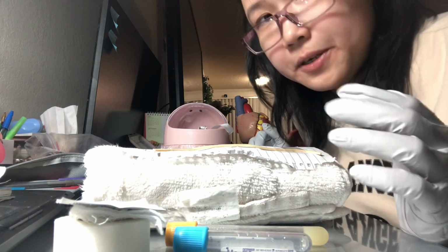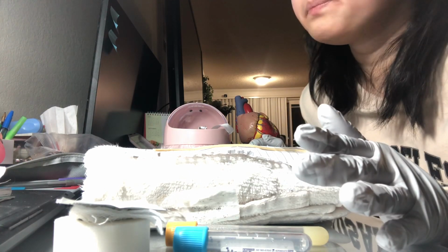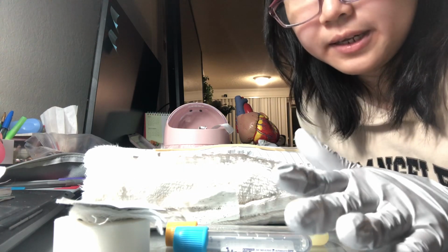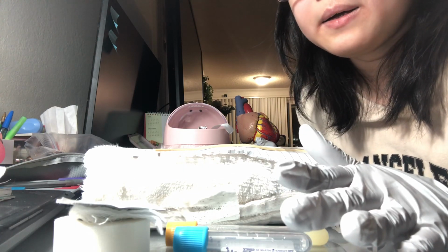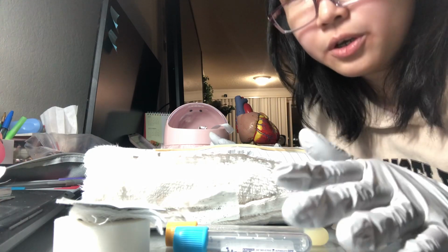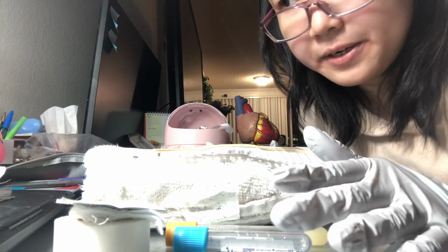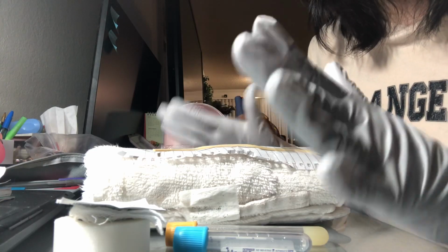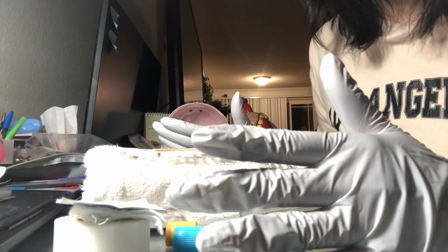The third question is, where on your body was the last successful blood draw? Have you had any issues with blood drawing in the past? So after I get everything written down in record about the patient identification and venipuncture history, I'll go ahead and perform the venipuncture procedure.